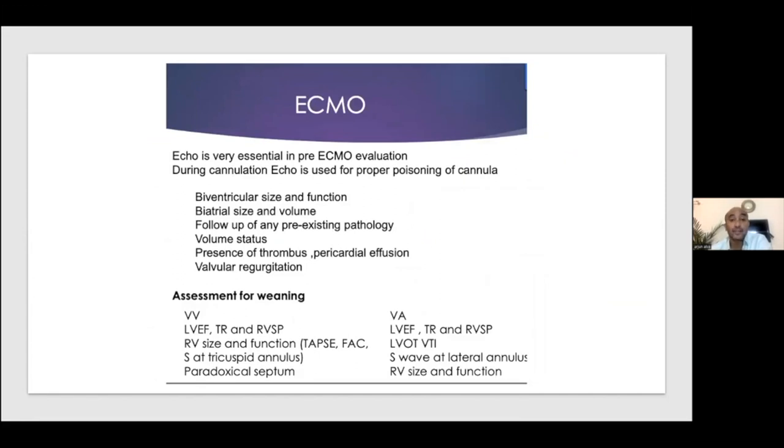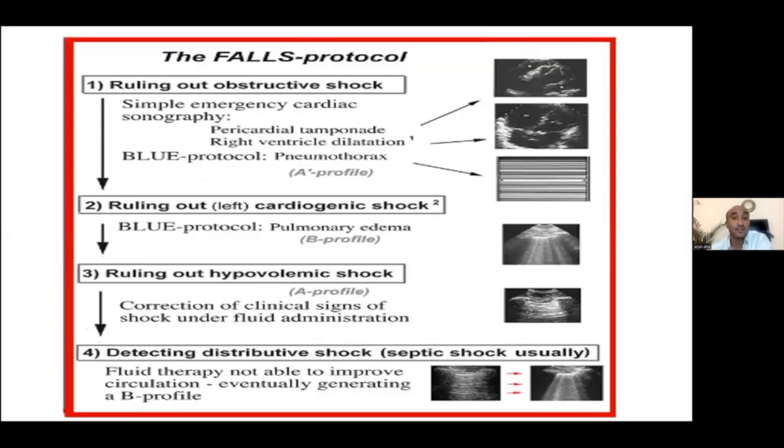Its role in ECMO: it helps in proper positioning of the cannulas during insertion of the ECMO. It also helps in assessment for weaning, let it be VA ECMO or VV ECMO. Echocardiography has a role in weaning patients from ECMO as well. There's something called a FALLS protocol, which uses both lung ultrasound and heart ultrasound to come to a diagnosis.